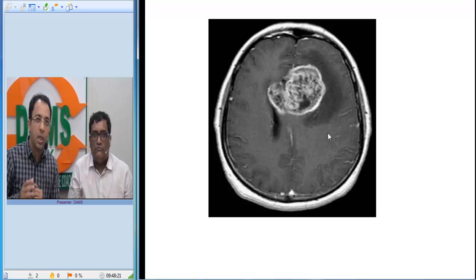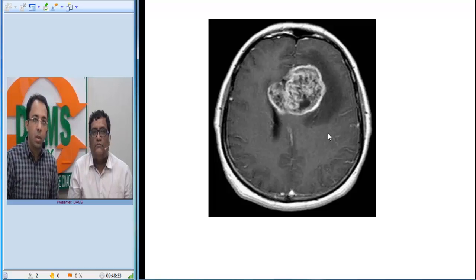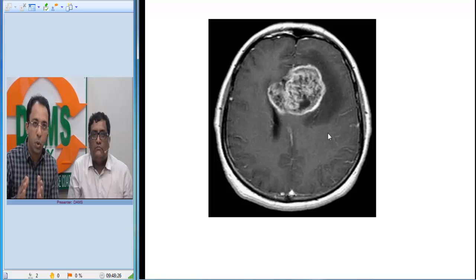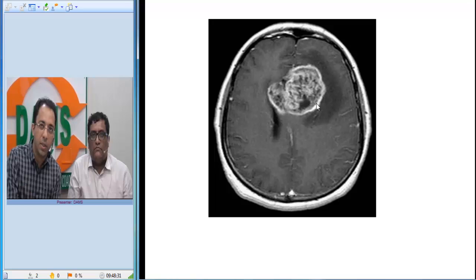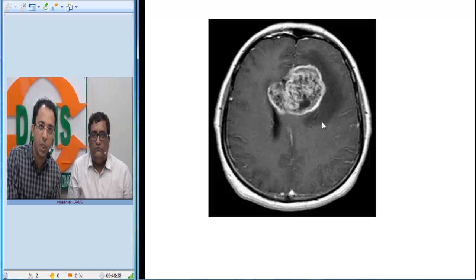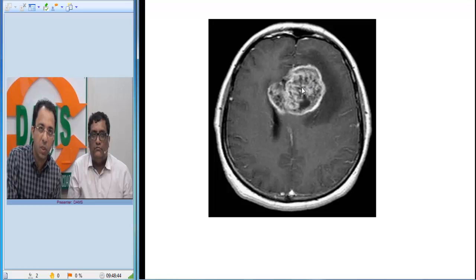Here is the MRI image. This is a post-contrast T1-weighted MRI image, and you can see an enhancing lesion in the left frontal region which is surrounded by edema. There is extensive surrounding vasogenic edema, and you have an enhancing lesion, but in between you will see areas which are not enhancing.